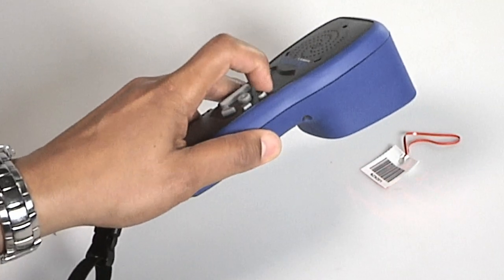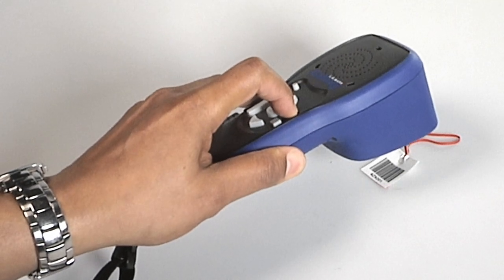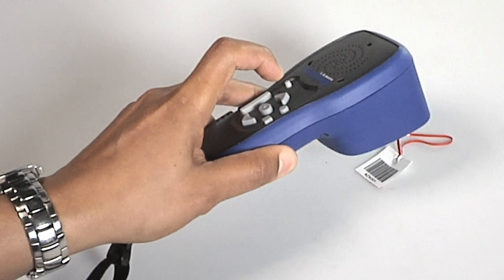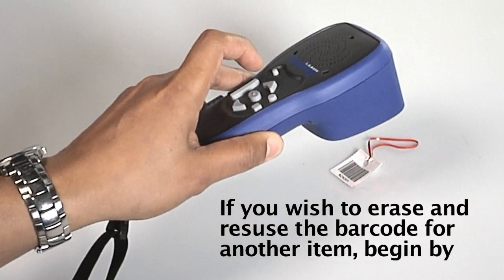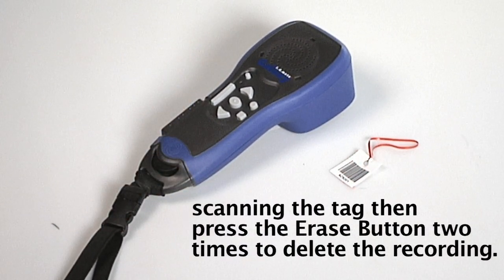To begin recording, scan the barcode. At this point, hold down the record button and speak into the device with the object's name. For example: press and hold the record button and say '2015 tax documents,' then release the record button when finished. You should hear the name announced when the record button is released. If you wish to erase and reuse the barcode for another item, begin by scanning the tag, then press the erase button two times to delete the recording.